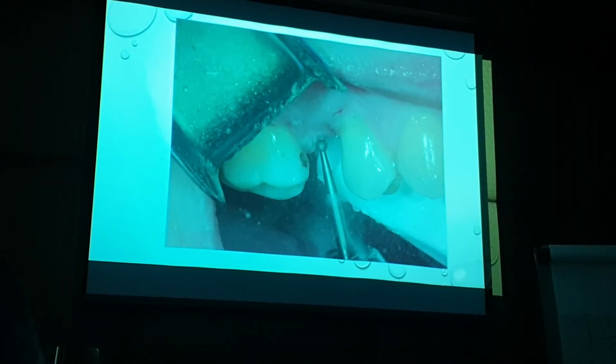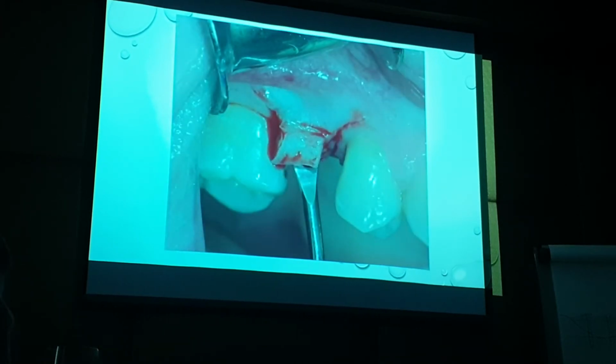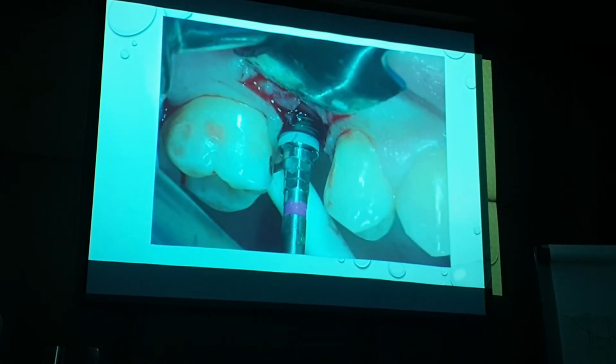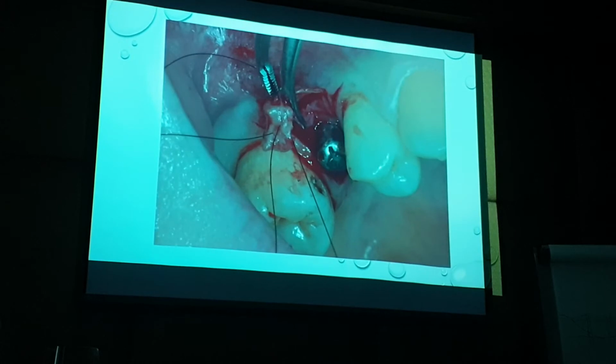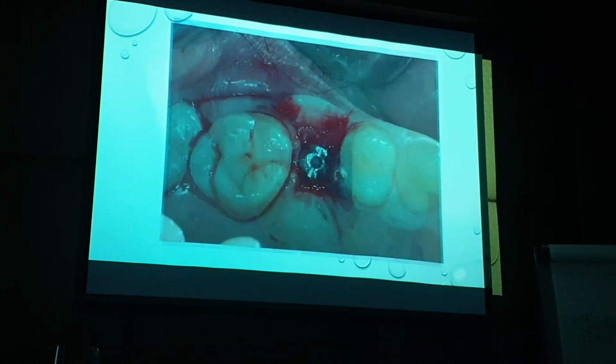For example, when we have a bone defect, we also have a tissue defect, and this is called a roll flap, where we can use, if we're doing an implant placement or implant recovery, instead of making a crestal incision, we can make it more on the palatal. We'll de-epithelialize the top of this flap. We'll open it from the palatal. And after we do our implant placement, we will literally roll the inside of that inside the flap and then close it. It's like doing a subepithelial connective tissue graft without having to harvest it from the palate. We take it from the site.